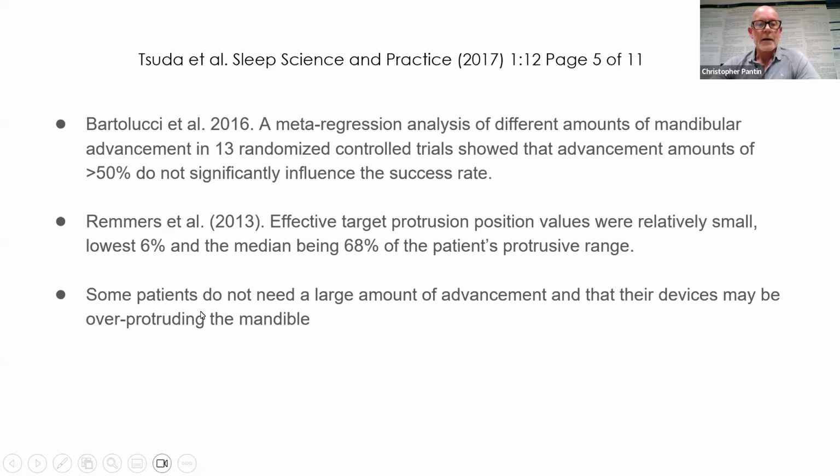Some patients do not need a large amount of advancement and their devices may be over-protruding the mandible. This gets back to the point of where you start and not starting too far forward, but not starting too far back. So you can see I've not really told you anything so far, because this is what titration is. There are no gold standards, there are no rules. You just need to be aware of what the science tells us and what clinical experience tells us.